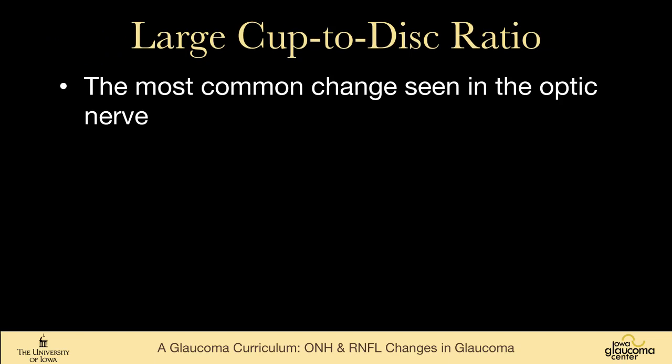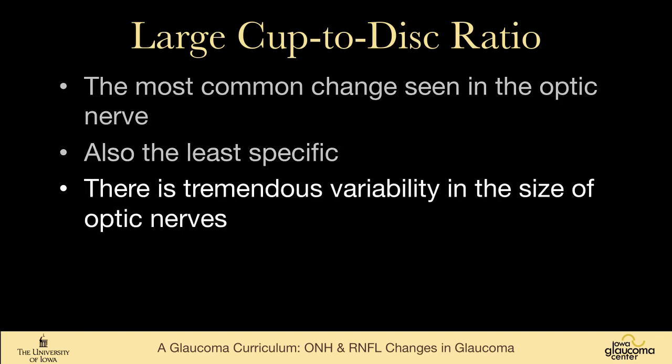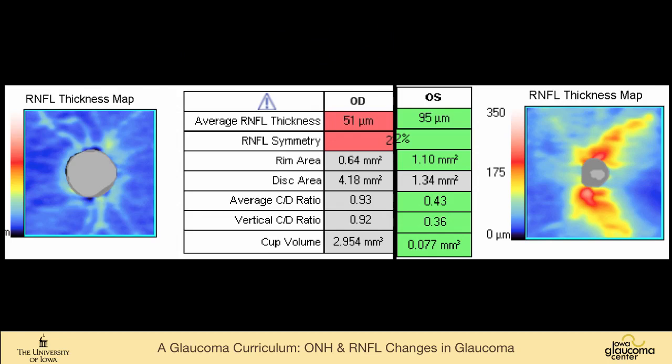So large cup-to-disc ratio is the most common change that's seen in the optic nerve in glaucoma, but it's also the least specific. There is, as I said just a minute ago, tremendous variability in the size of the optic nerves. So these are 2 nerves from 2 different individuals. Very large nerve on the left side of your screen in someone who also has glaucomatous damage. Very tiny nerve on the right side of your screen. You can see the disc area in these 2 eyes, again 2 different individuals, are 3-fold different in size.